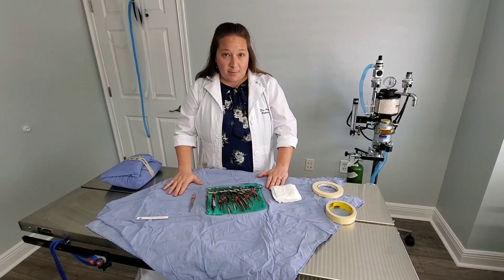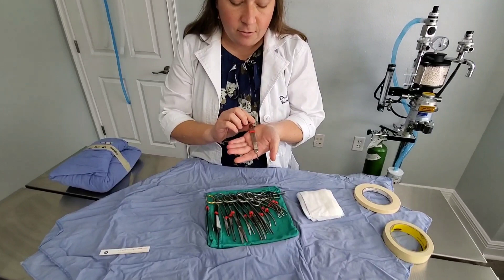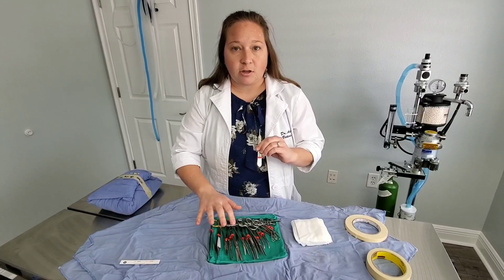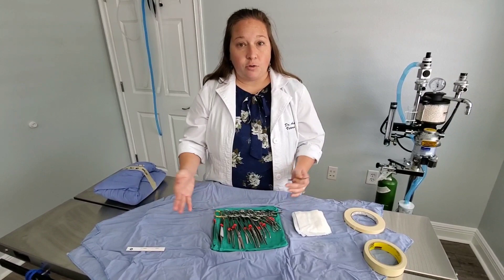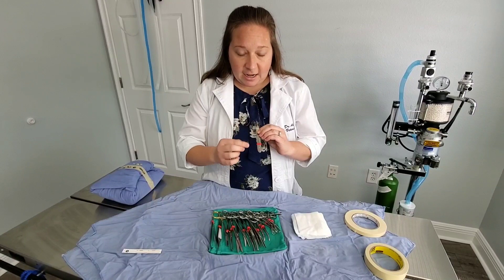We're going to start with our spay pack. This is called our scalpel handle or blade handle, and we have ours color coded to help us remember which instruments go in each pack — to keep them together when washing multiple packs at a time. This one was recently used, cleaned, and dried, and we're getting ready to pack it up again to go into the autoclave and get sterile.